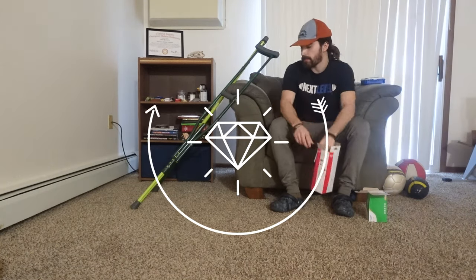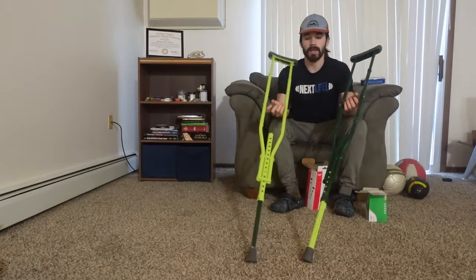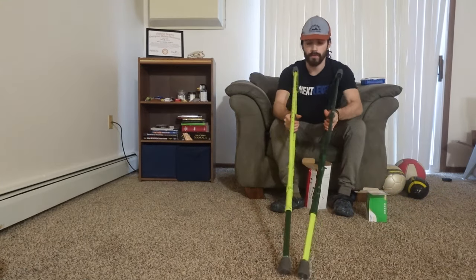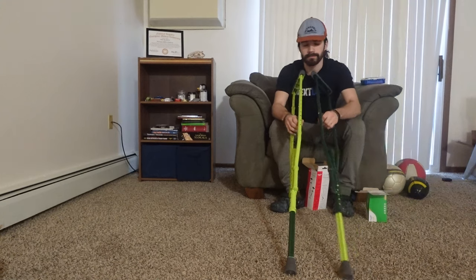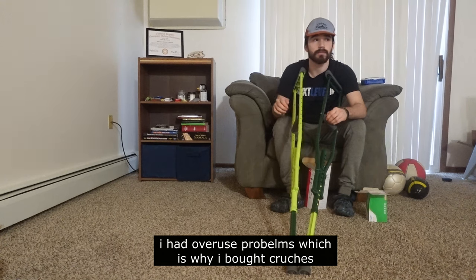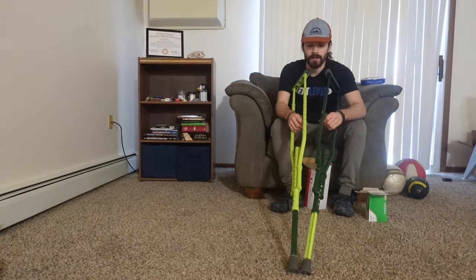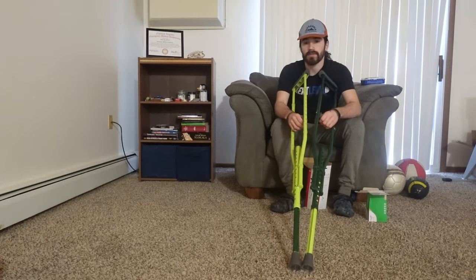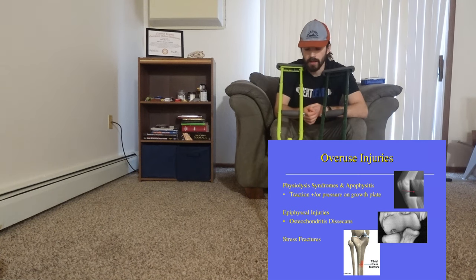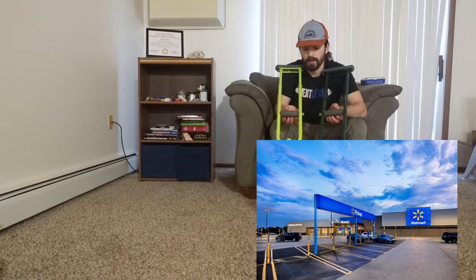So I have my crutches, my customized crutches. I bought these crutches for when I had really bad knee pain. I had horrible knee pain from working out and that's called overuse — I had an overuse injury in my knee. And I bought these crutches at Walmart to help me with my injury.